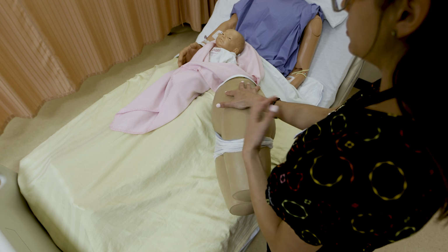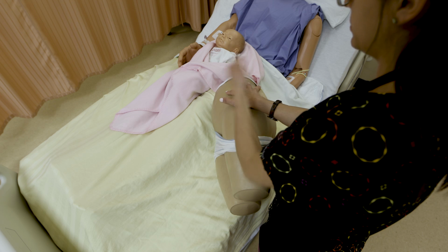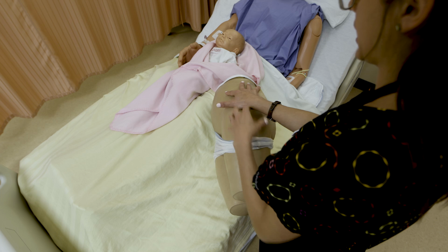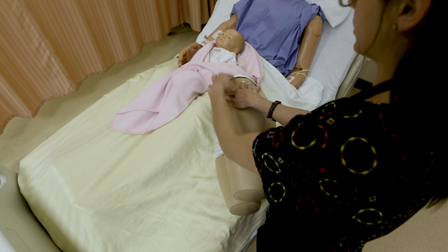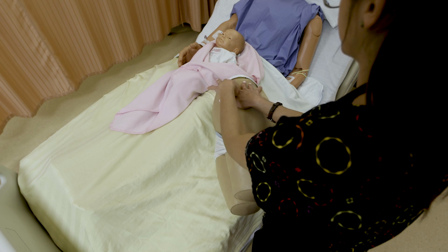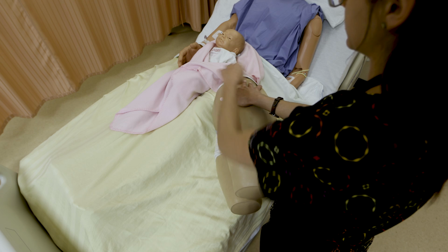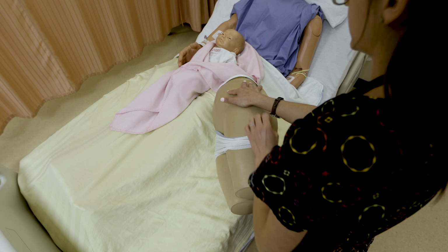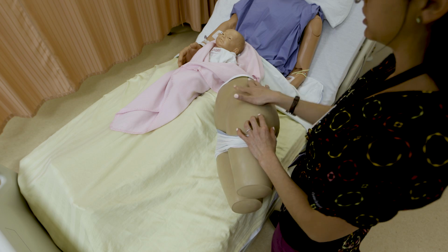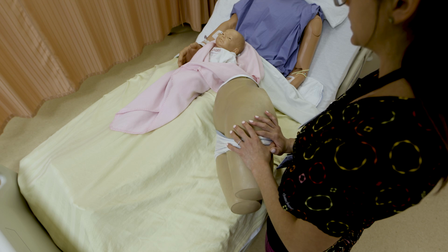And just to note, you wouldn't want to inject between your two fingers because you put yourself at high risk of being poked. So you'd want to landmark with your hand and then maybe place the alcohol swab there so that you have that landmark noted, or maybe the person has a mole there, something that tells you I'm going basically just there, because you can go pretty much anywhere in this V. So we want to landmark it with something like an alcohol swab is common, and then you're actually going to remove your hand for the injection. You don't want to go between your fingers. So that's landmarking of the ventrogluteal site.